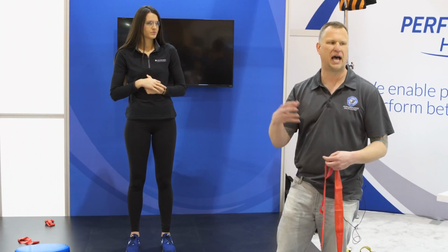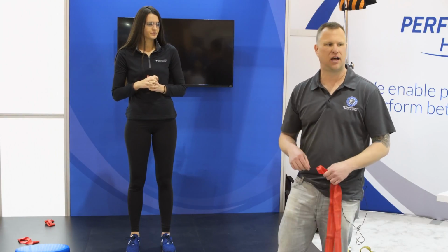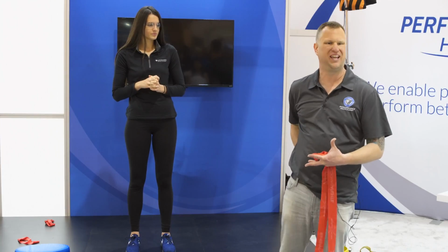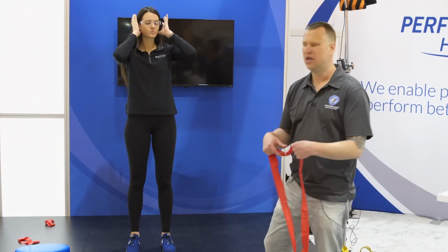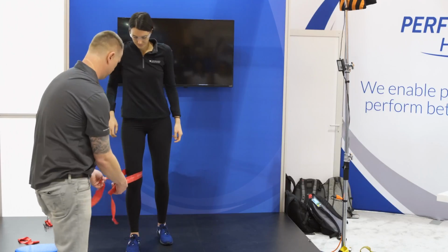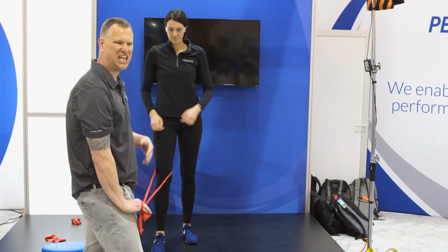Doing a quad set over a towel or a pillow, things of that nature on a table, is not very functional. And for those of us, if you've never done it yourself, sometimes there's a little bit of difficulty in understanding the movement patterns. A lot of patients will prematurely extend their hip. They can't quite feel it. So one of the things I like about the CLX is I can just loop that around the back of the knee, and I can pull that and anchor that off again to the CLX station. Now the band right now is trying to pull that knee forward.